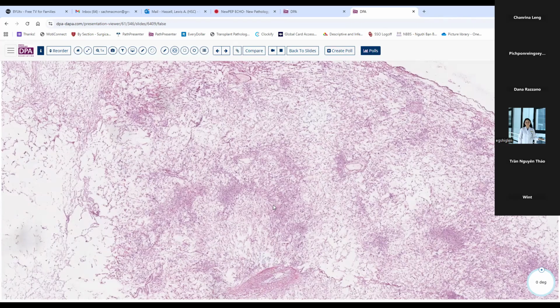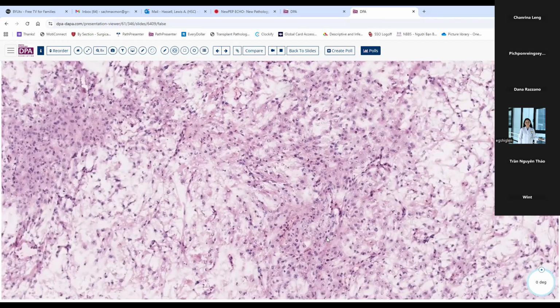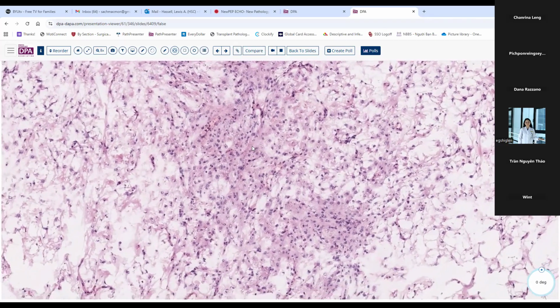Okay. Because this looks like some pink areas and some edematous areas. I think of Krukenberg. I'm going to dive in and look for signet ring cells, and if I don't see them, then okay. And some of these look little.